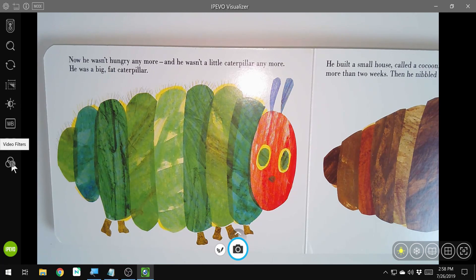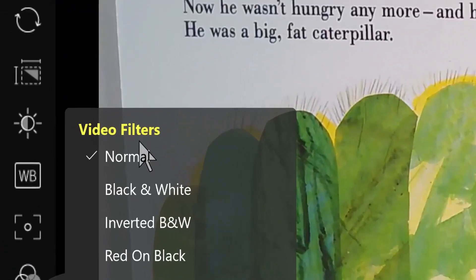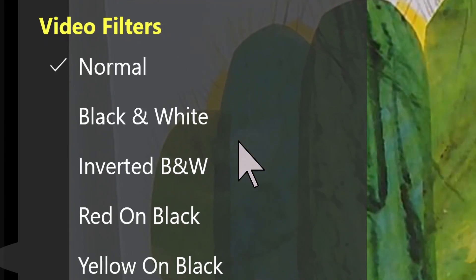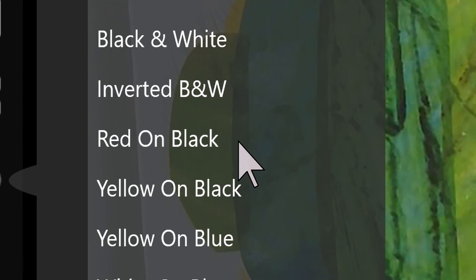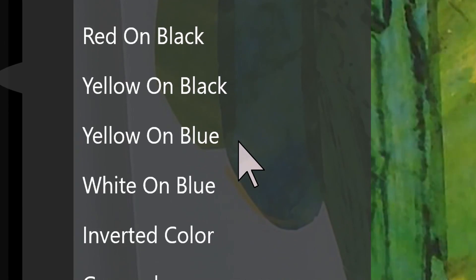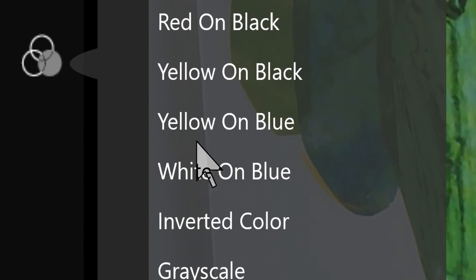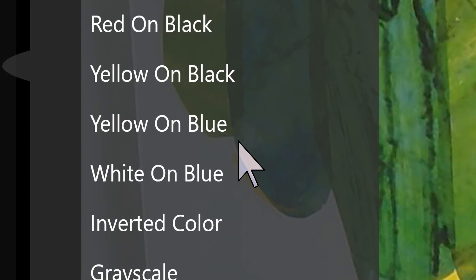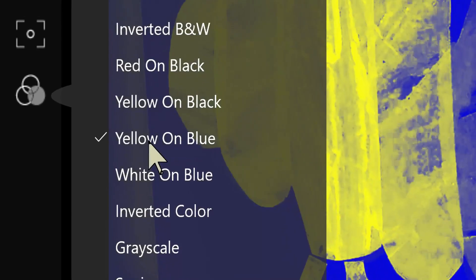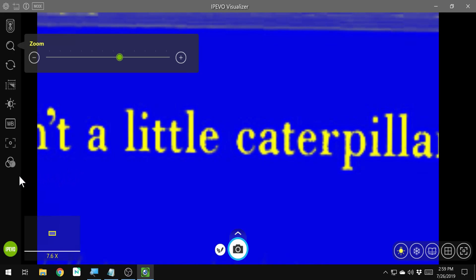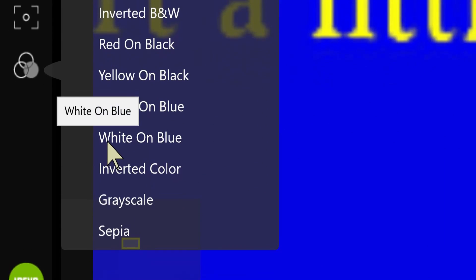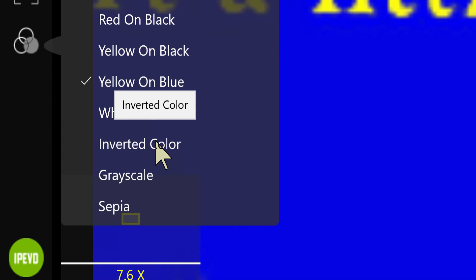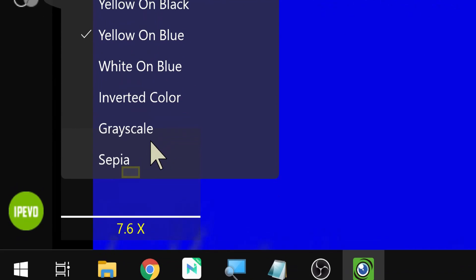I also want to talk about the different color filters. We have a list of filters: normal, black and white, inverted black and white, red on black, yellow on black, yellow on blue — yellow on blue is terrible, I very rarely meet anyone who likes yellow on blue. Let me know in the comments if you prefer yellow on blue. Then we have white on blue, inverted color, grayscale, and sepia.